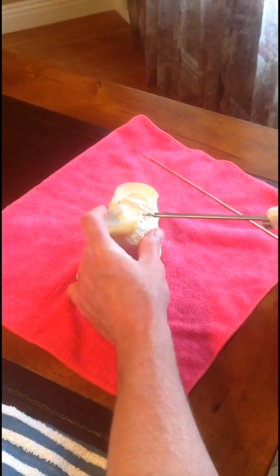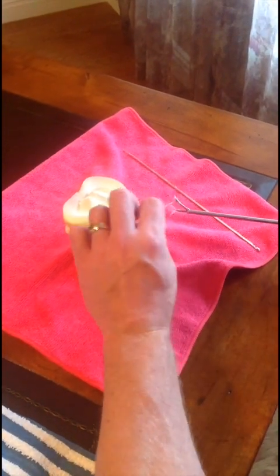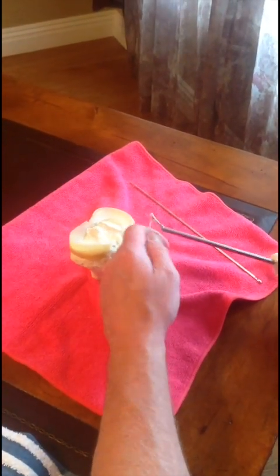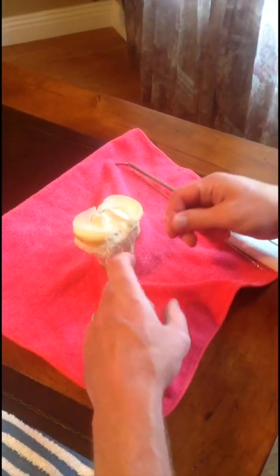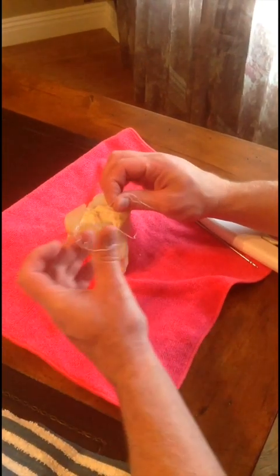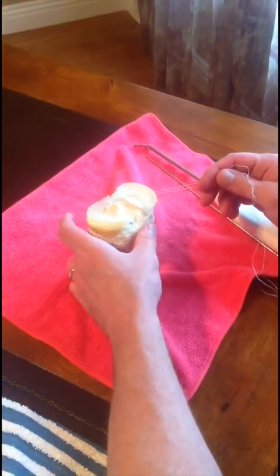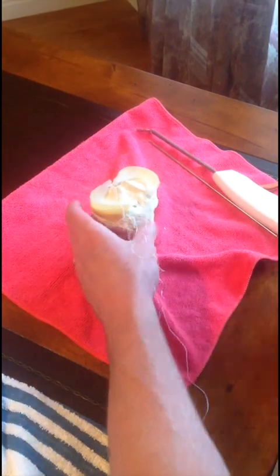Here I'm showing how I like to pass on the posterior horn with the NovoStitch Plus device. I'll go ahead and pass both limbs, which will leave me the loop in the bottom jaw. I can just retrieve this loop out of the bottom jaw, and then pulling my top sutures from the upper jaw I simply tuck these through the bottom loop — that makes an easy luggage tag. I don't have to worry about suture shuttling because I'm coming straight in and out of the same portal, and I do not use a cannula for this because that technique keeps you from getting good suture angles.